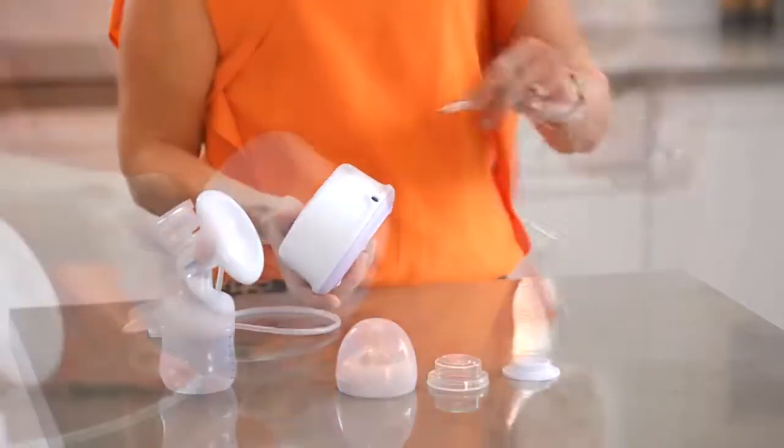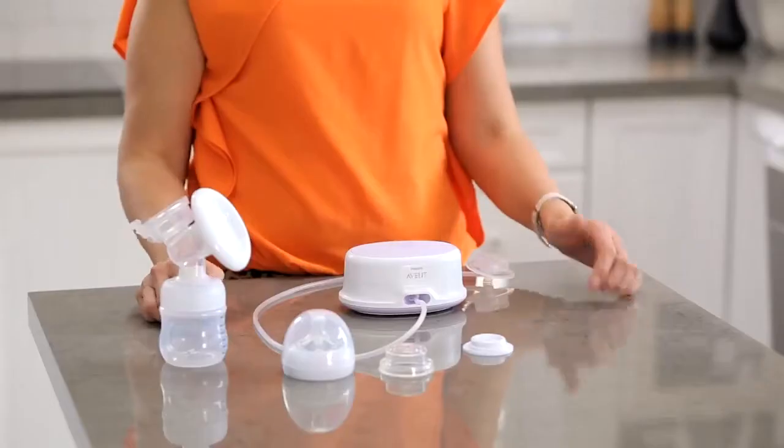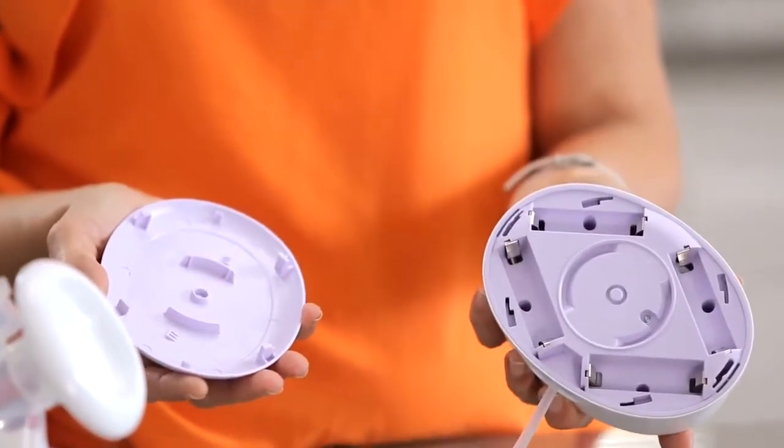Plug the power cord into mains power and connect the power into the back of the motor like so. You can also charge the breast pump with batteries, which you can place underneath the motor like so.